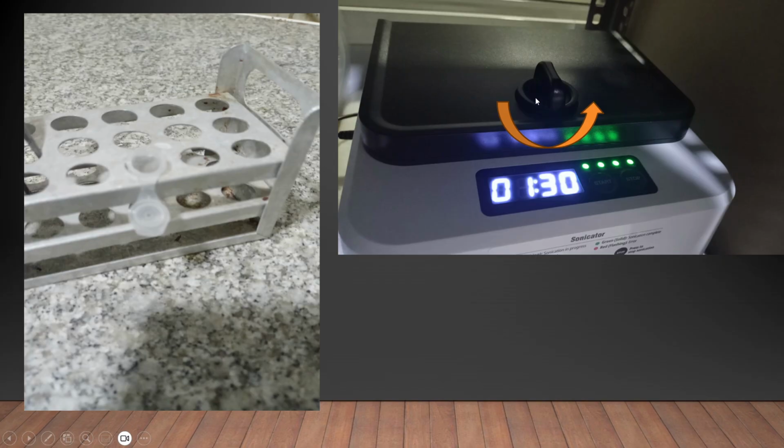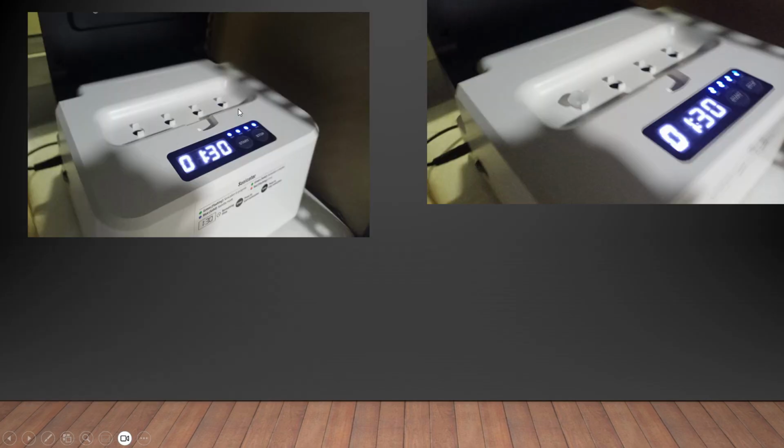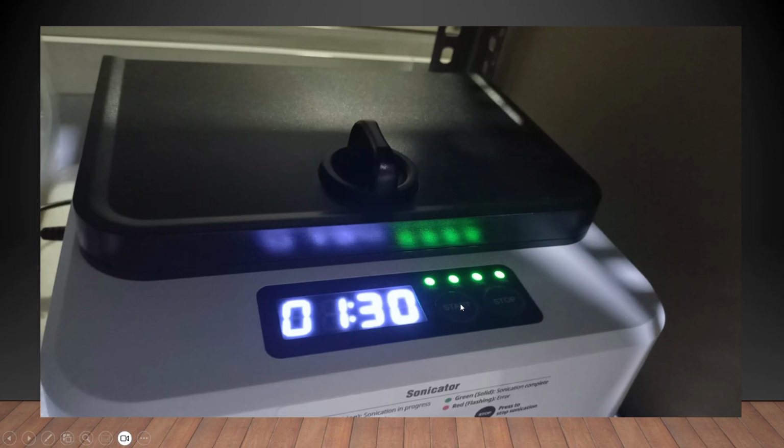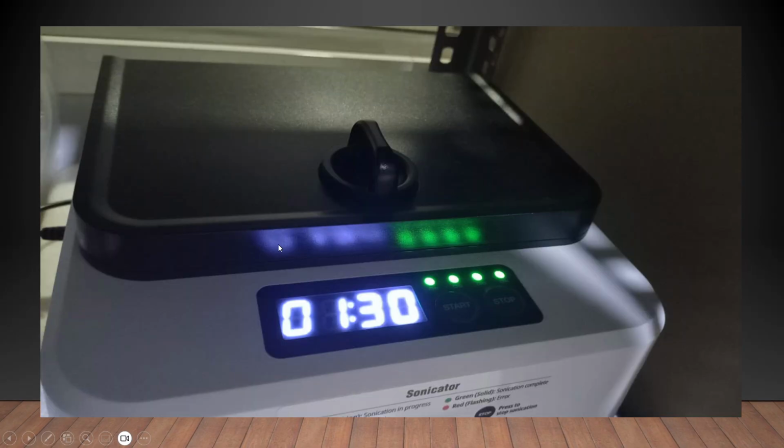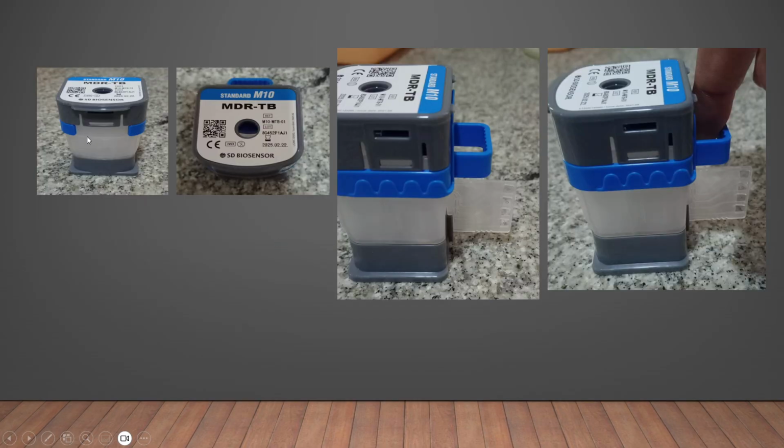Then sonicate it. So you slowly open this. If you turn this knob to the left, to the right side, it will open. Once it opens, keep it in one of these positions, then close it back and give a start. Once you give the start, whenever the instrument is ready, it will become green in color. It will start blinking for the next 1 minute 30 seconds, and once it is ready, it will be done. Now you take out the cartridge.